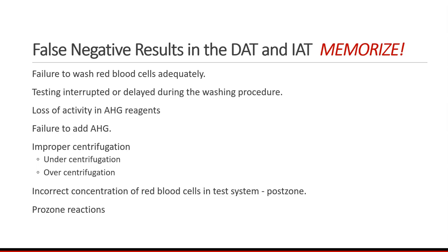So the funny story is they had already approved blue for anti-A, the dye. They had already approved yellow for anti-B. So this really bright person said, why don't we put them together and then we'll have green and we can use this for our Coombs reagent. So this has been a wonderful addition because now when you spin down, after you've done the Coombs test and you're reading, if there's no green in the supernatant fluid, then you didn't add the Coombs reagent. So it's just saved you 30 minutes.